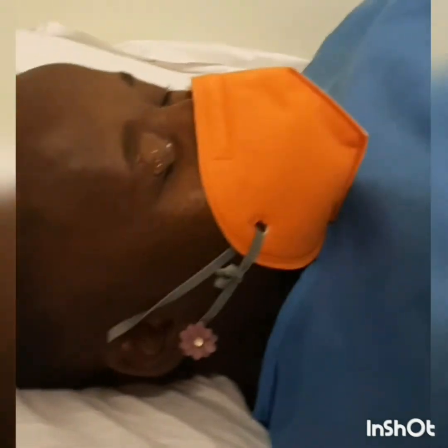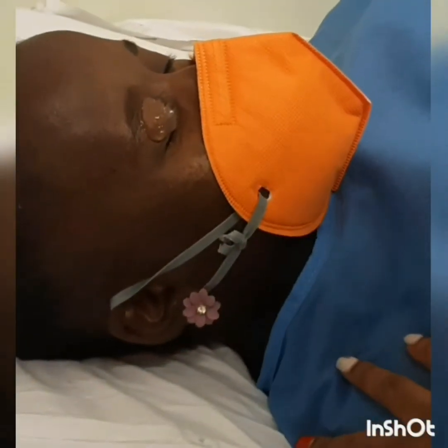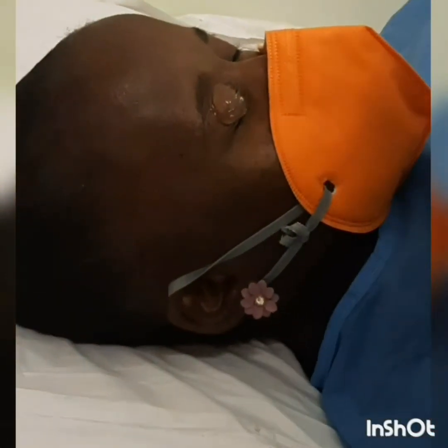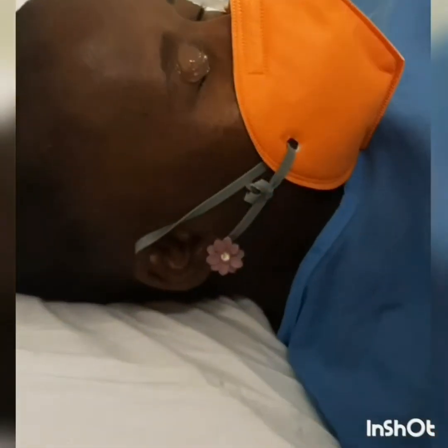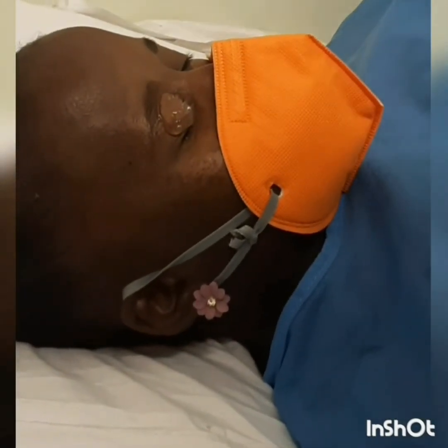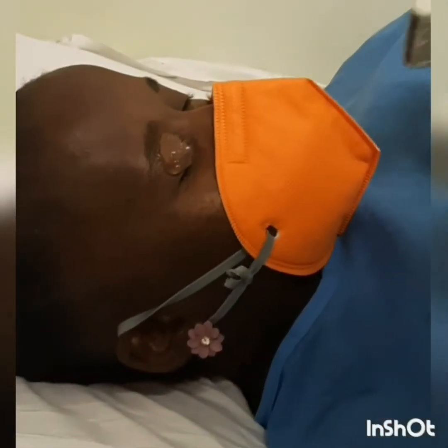Okay, and so now we are going to start with the exam. When you start the scan for ocular ultrasound, you can either have the patient lying straight, or with the bed raised up a little bit, maybe less than 45 degrees, depending on the most comfortable position for your patient. Especially in emergency cases, most of the time you will find that the patient is completely supine.